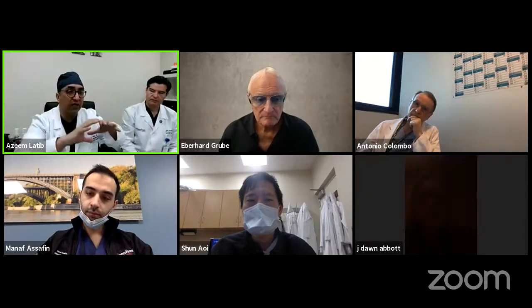She made a comment that I think she's used it. I'm going to ask her to make a comment about the balloon. Antonio, I think we saw this for a while. It was available in Europe. It's a special balloon that has a distal part and then a larger part, so it allows you to really expand the ostial part. Dawn, thanks for joining us. Maybe you want to comment. Have you used Ostial Flash?